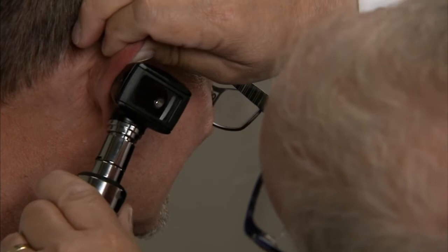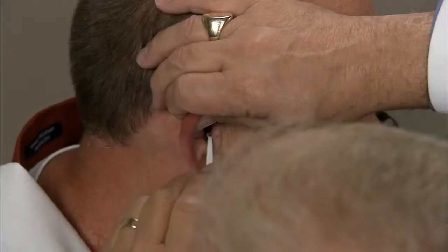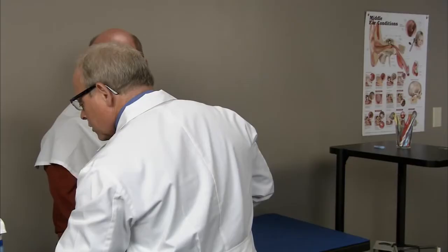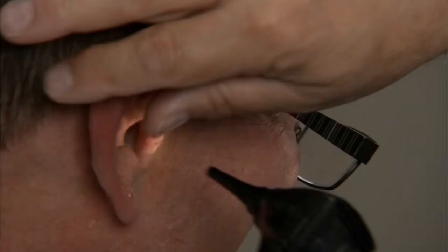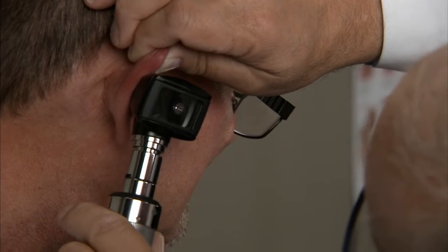So sometimes the wax comes out in large chunks and won't fit through the exit portals. When that's the case, it'll come just to the end of the ear canal, and then you can use an ear curette to remove a large chunk of wax. So now we can take another look in your ear and see what we're doing. And we have completely cleaned the ear canal from all the wax.